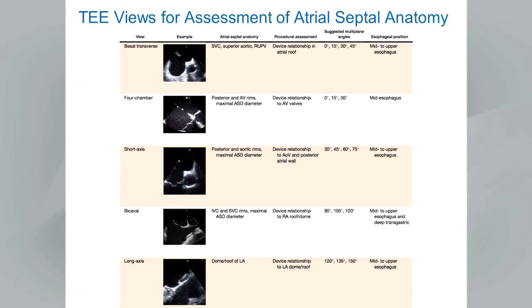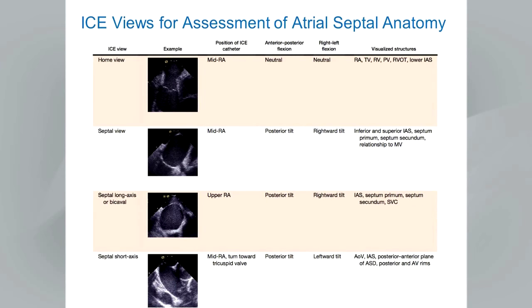If 3D echo is not available, we step through the five key 2D TEE views in small 15-degree angle increments, interrogating the intra-atrial septum much as we would the mitral valve. For intracardiac echo, there are three key views and one starting view — the home view. The catheter is placed in a neutral position in the right atrium and the imaging sequence is choreographed from there. The three key views are the septal view, the septal long axis or bicaval view, and a septal short axis view.